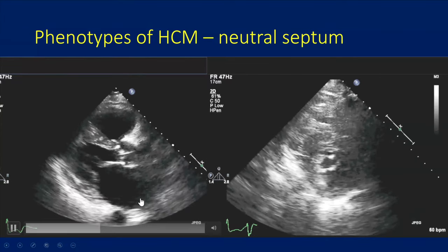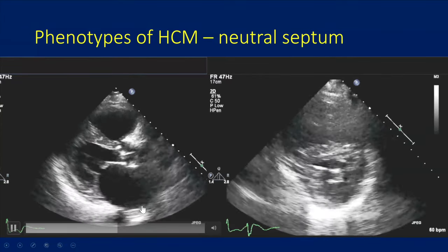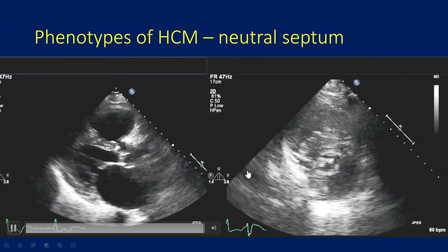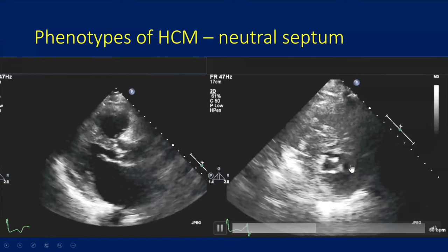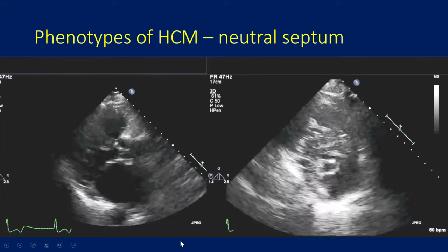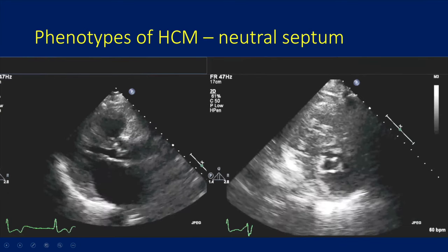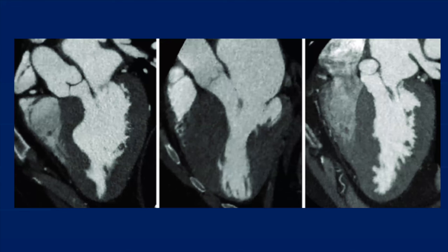The neutral septum can be a bit more subtle. As we can see, there's diffuse thickening everywhere through the LV with no particular focal thickening — this one can be pretty easily missed as just hypertensive heart disease. On MRI we appreciate this a bit better. Here you can see the sigmoid septum variant, the reverse curve variant, and the neutral septum variant. In the neutral septum the septum is straight and the LV cavity is not distorted; in the reverse curve the LV cavity has significant distortion with a convex shape; and in the sigmoid the LV cavity is more oval. There's lots of thickening everywhere in the LV.